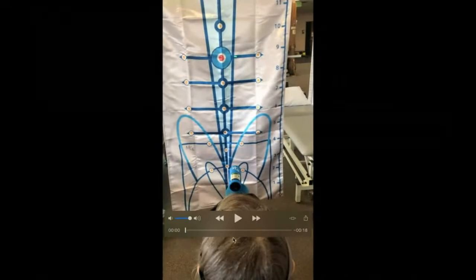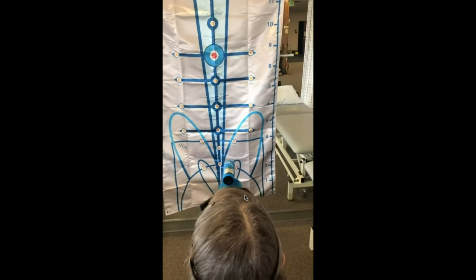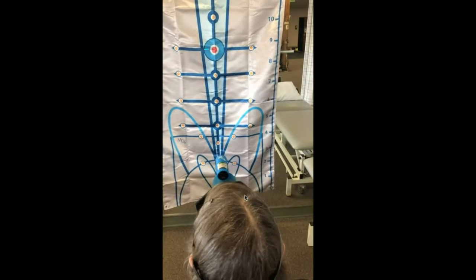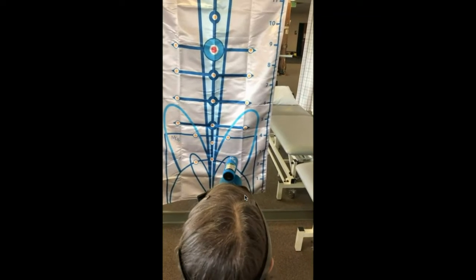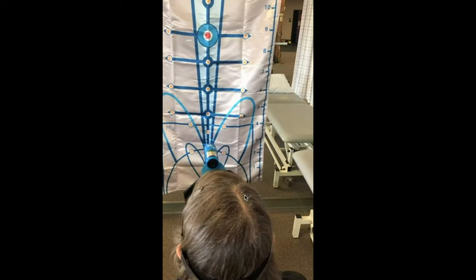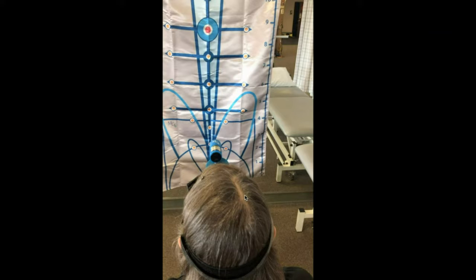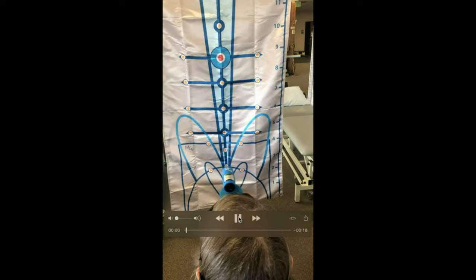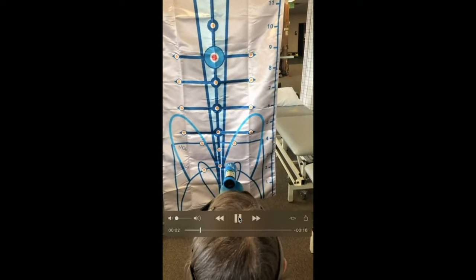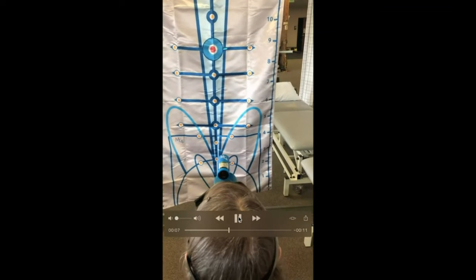And so as we keep going here with this practice with her, you'll definitely see an increased uniformity in her excursion side to side. It's not perfect, but this is all inside one training session, just different repetitions with it. Less titubation going up and down. She's getting a better understanding of what level on the horizon is with her VOR, and she's showing dramatic improvement by allowing herself to get better understanding with visual representation of this.